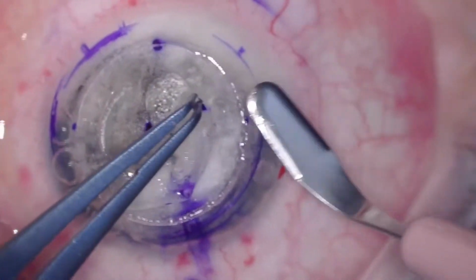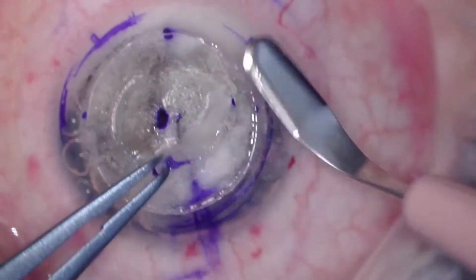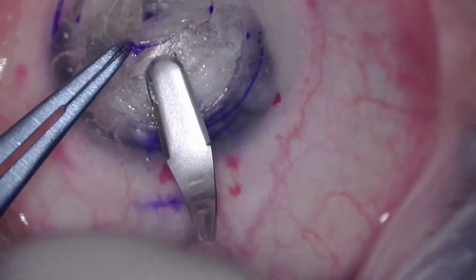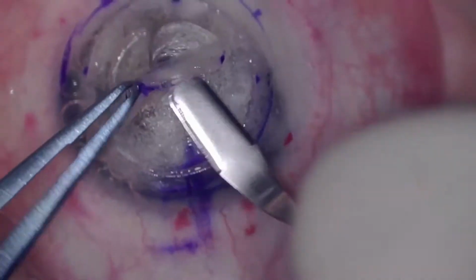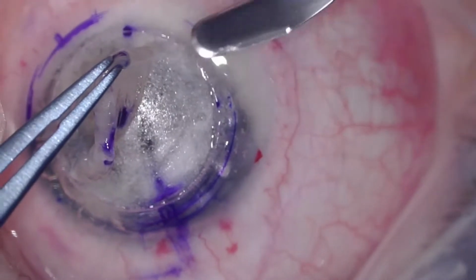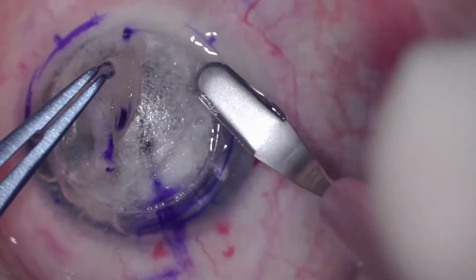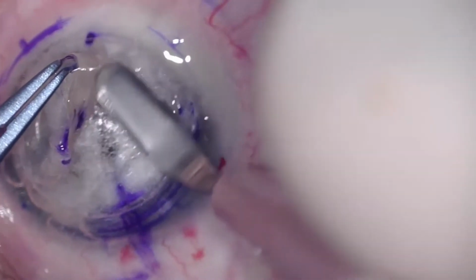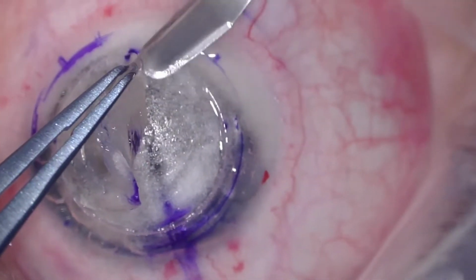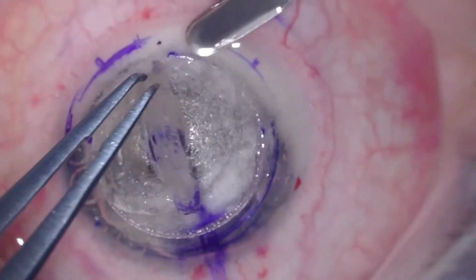So I've got a little bit of time now to talk about things to remember when you're doing a DALK. The first thing is you don't necessarily need a Flieringa ring with these cases. You've got the structural integrity there already if you get a successful deep dissection and retain the posterior fibers and the Descemet's membrane. The other thing is, I've had the question of whether you should leave the intrastromal rings in when you're doing the big bubble. My personal preference is to remove the rings before doing this, but be very careful not to perforate the cornea, as I've shown at the beginning.